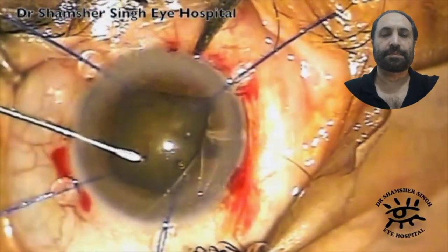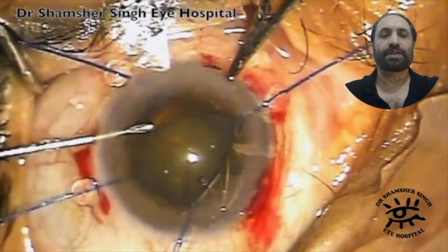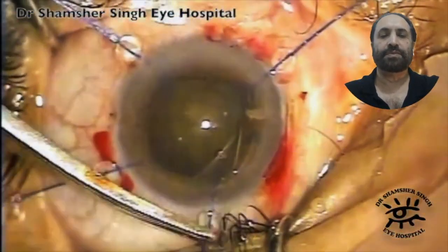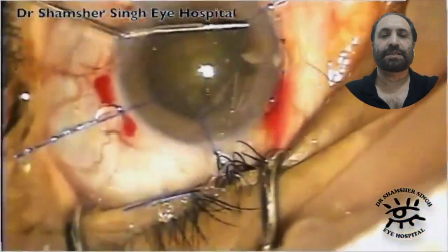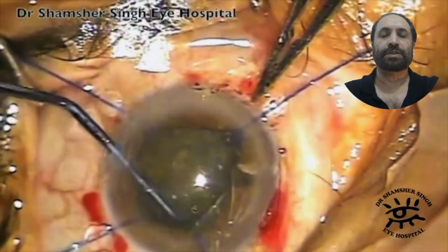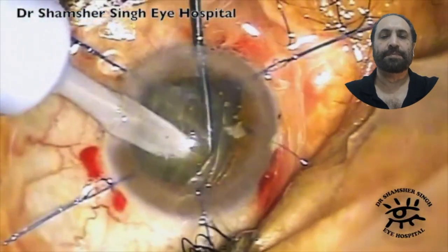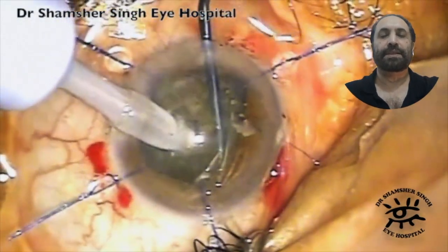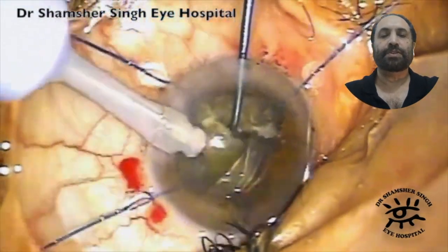Then I inject the viscoelastic and do the capsulorhexis. From here on it's quite a routine case, but there are a couple of things to keep in mind. One is that when you do the paracentesis for the iris hooks, please do them maybe about two millimeters away from the limbus. If it is too close to the limbus, it's going to pull the iris forward and your anterior chamber is going to become shallow. That is one thing we must keep in mind.